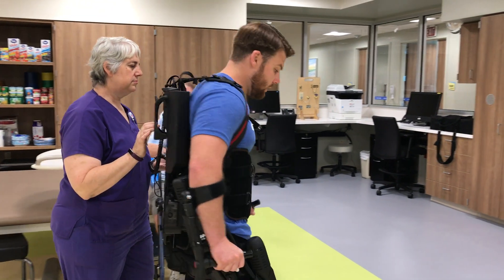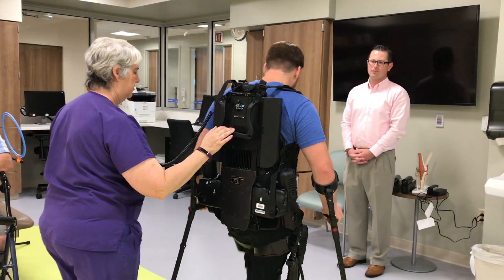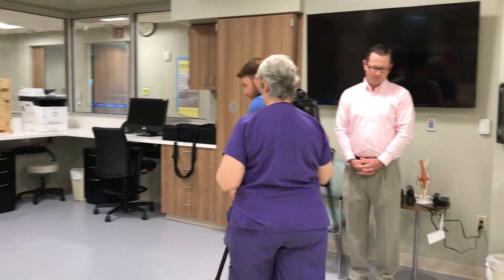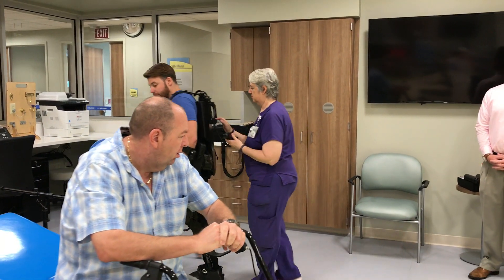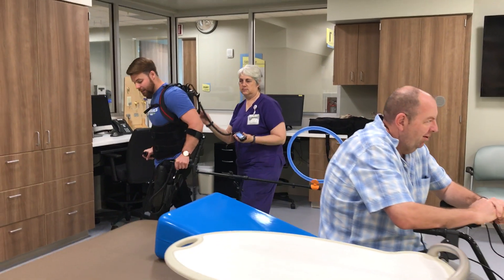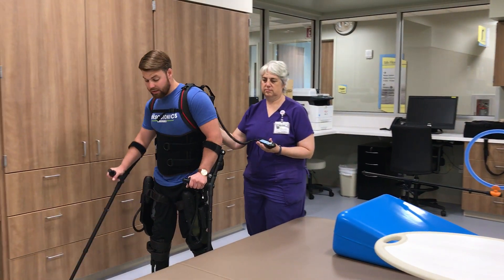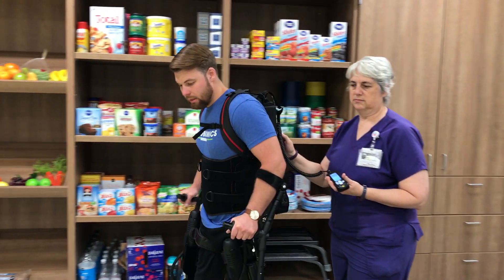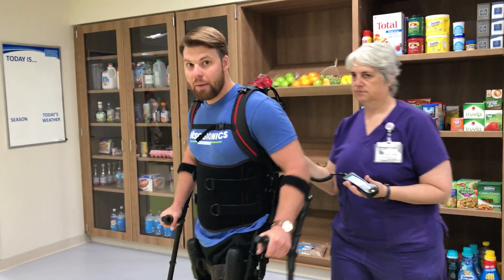I have some hip flexion, so I can use that device — when I walk, I can help initiate the step and use the ability that I have. Whatever I don't have, the device will adapt and kick in and finish for me. So I can work on strengthening the muscles in my legs, work on recovery and rehab, and just walking again.